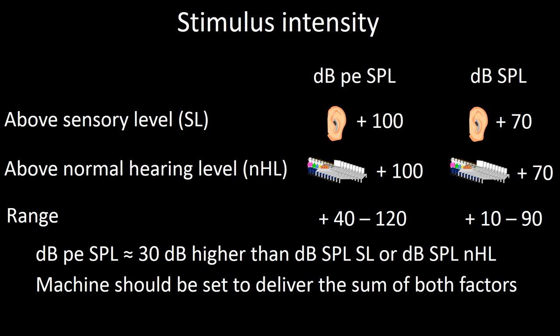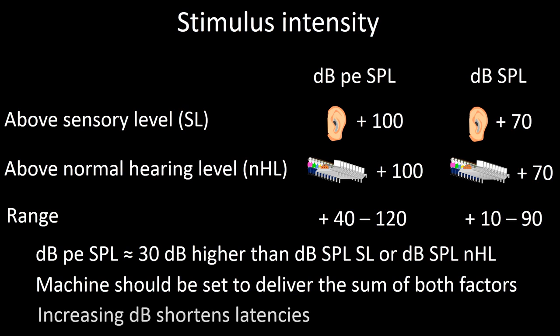Another important thing is that most machines are set to deliver the sum of both, and that increasing the dB shortens latencies.